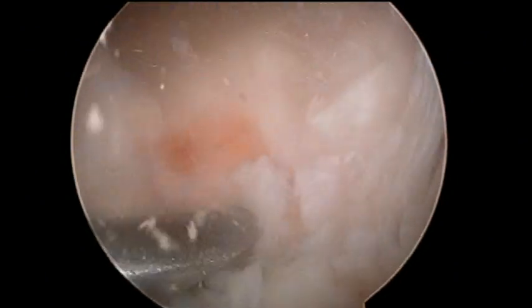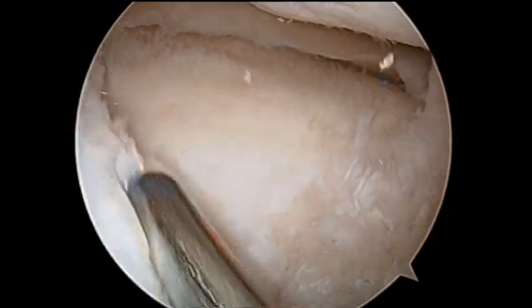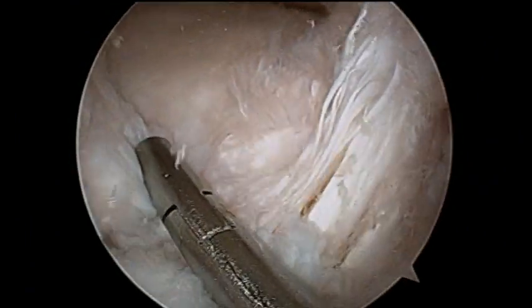After degenerated tissue removal, a bed is prepared on the lateral tibial plateau to perform the anterior horn reinsertion.